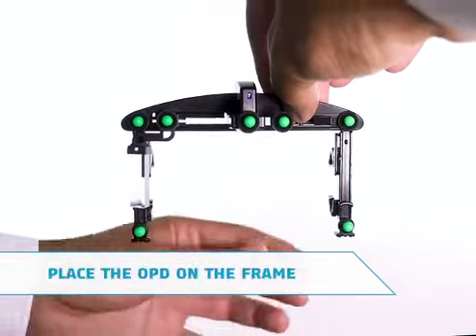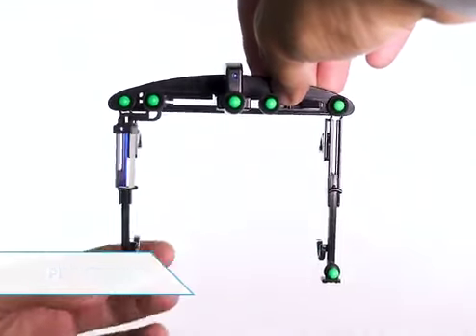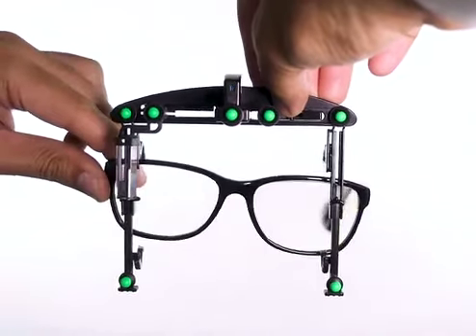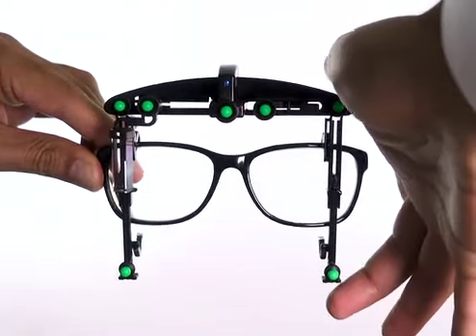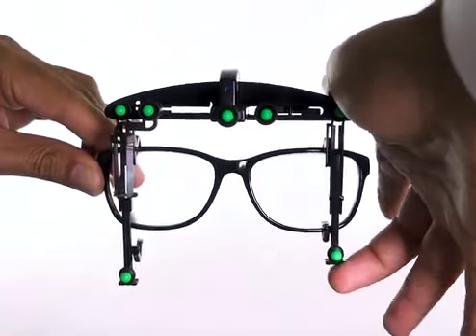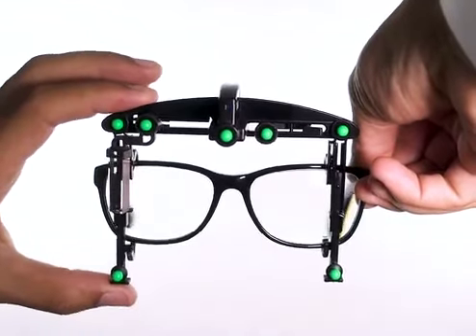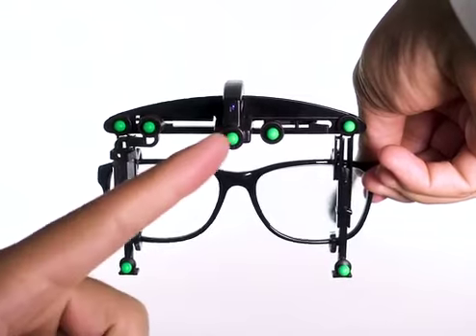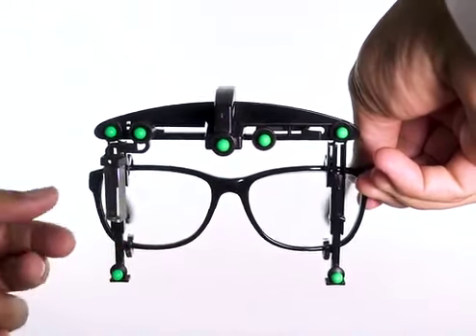The lower frame hooks are extended by holding and pulling the bottom edge of the OPD leg. To mount the Optikam Posture Device on a frame, position the top hooks on top of the frame, then proceed to close the lower legs to secure the OPD. Make sure that the OPD is relatively centered on the frame, using the OPD center post as a point of reference.